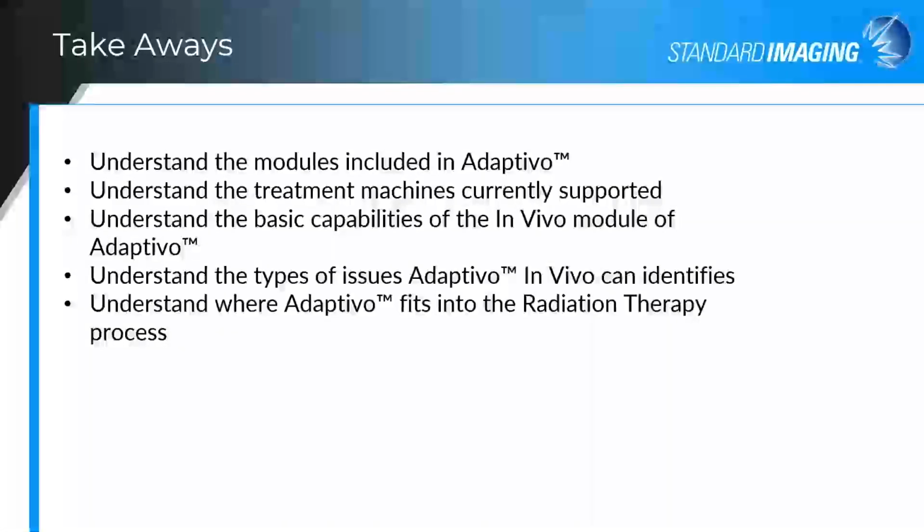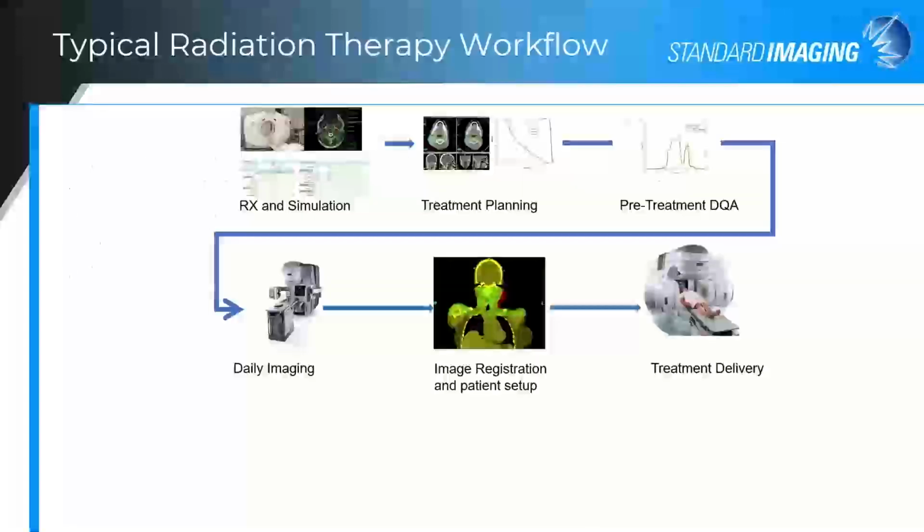So here are the takeaways today that I'd like you to walk away with. I'd like you to understand the modules that are included in the Adaptivo software, understand the treatment machines currently supported, understand the basic capabilities of the INVIVO module, understand the types of issues INVIVO can help identify, and then understand where Adaptivo fits in the radiation therapy process.